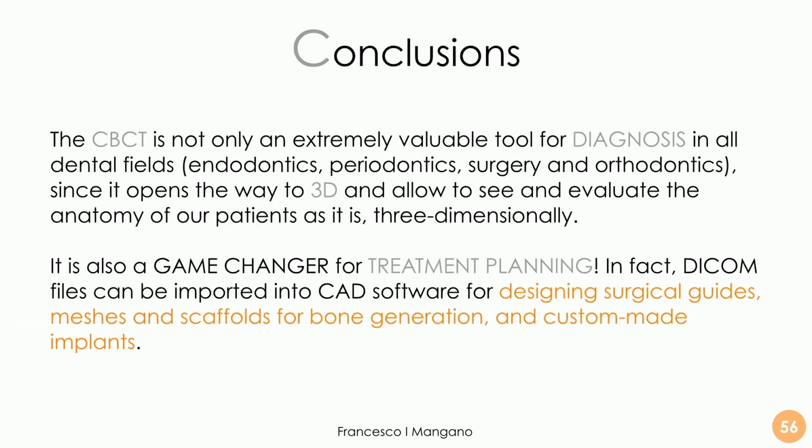So the cone beam computed tomography is not only an extremely valuable tool for diagnosis in all dental fields, from endo to perio, surgery, orthodontics, since it opens the way to 3D and allows us to see and evaluate the anatomy of our patient as it is, three-dimensionally, and so better. Cone beam computed tomography is much more. It's also a game changer for treatment planning. In fact, the DICOM file can be imported into computer-assisted design software for designing not only surgical guides, but also meshing and scaffolds for bone regeneration and custom-made implants, in the latter cases using the powerful tool of segmentation.